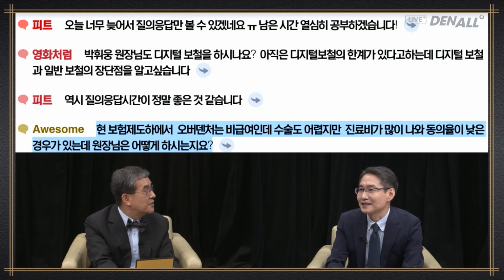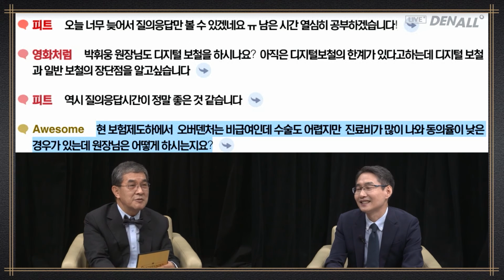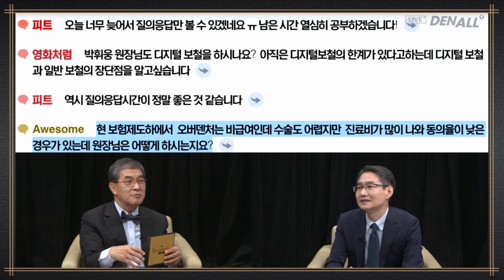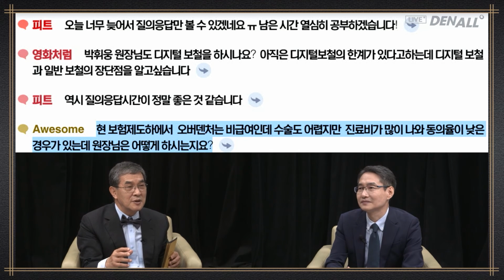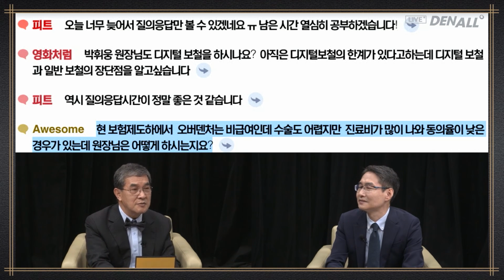I rarely do overdenture these days. Rather than placing 2 implants, I would rather place 4 implants and provide a fixed prosthesis. In my opinion, the percentage of overdenture is decreasing. You prefer providing fixed bridges and you have a lot of experience at that end. However, I believe there are still some people who provide overdenture. I believe that a bridge is much better compared to a denture.